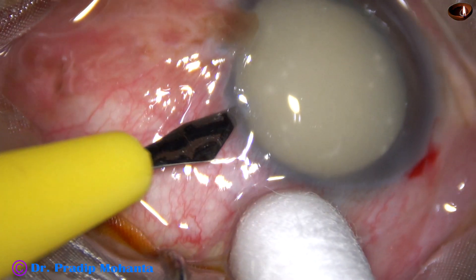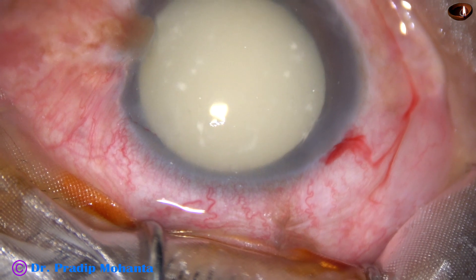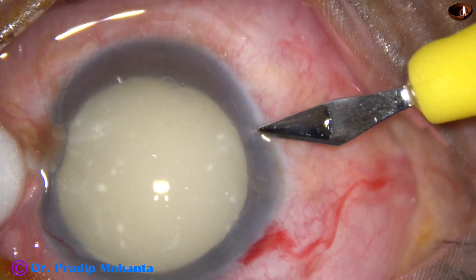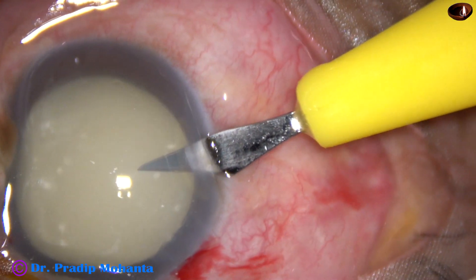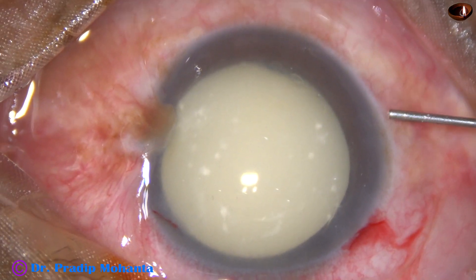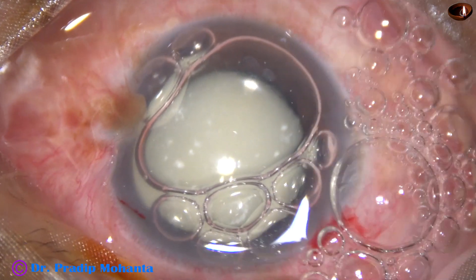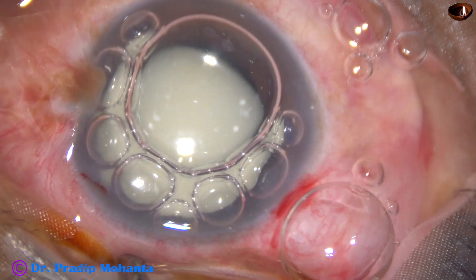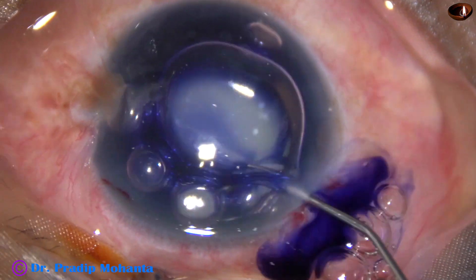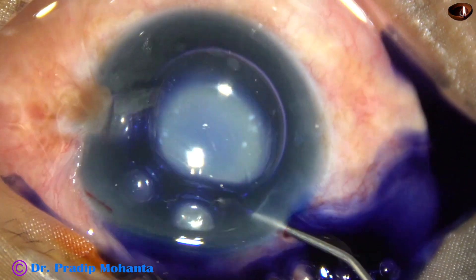By this time, the main incision and a side port on the left side of the main incision has been made, and this is another side port at around 8 or 5 o'clock. A big air bubble is injected into the anterior chamber. The air bubble breaks into many air bubbles. This is trypan blue, 0.06% dye to stain the anterior capsule.